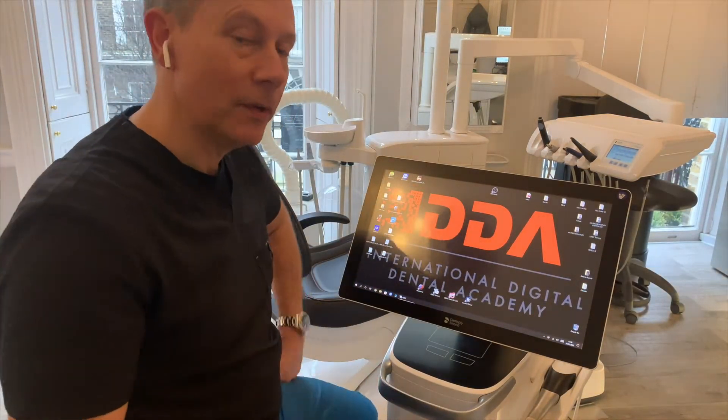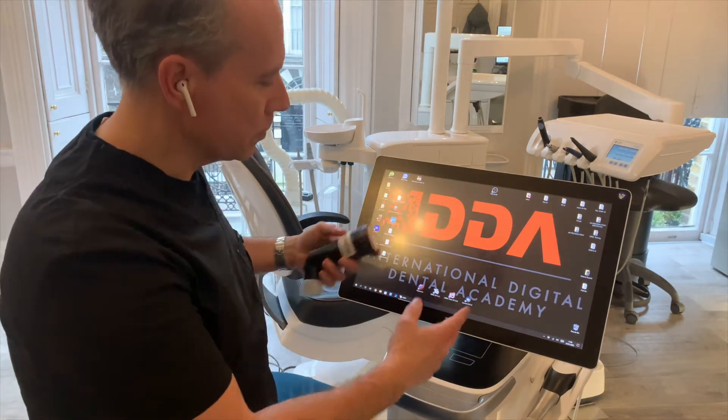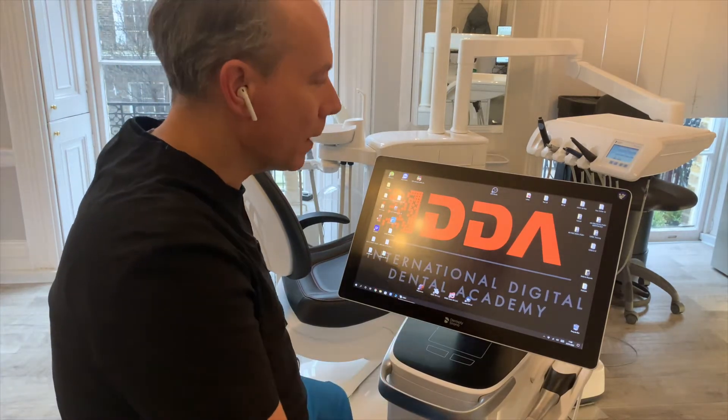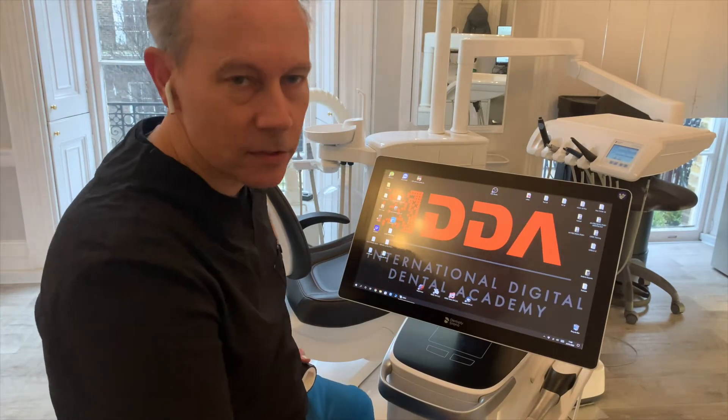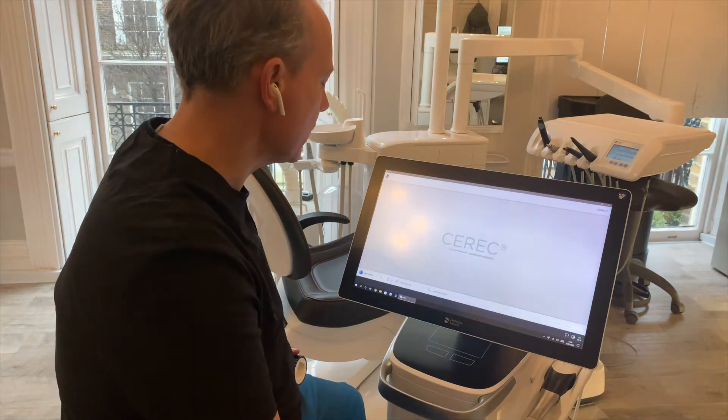Hello, today we're going to have a look at calibrating your scanner. For this you'll need the PrimeScan calibration tool that comes with your machine and of course the actual scanner. On my PrimeScan I'm running a number of different software options but today we're going to use the latest version of the normal CEREC 5.2.